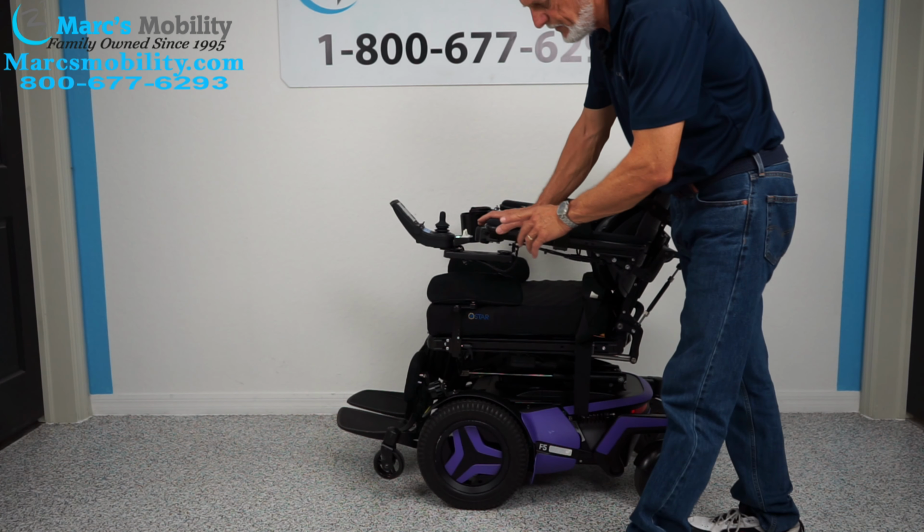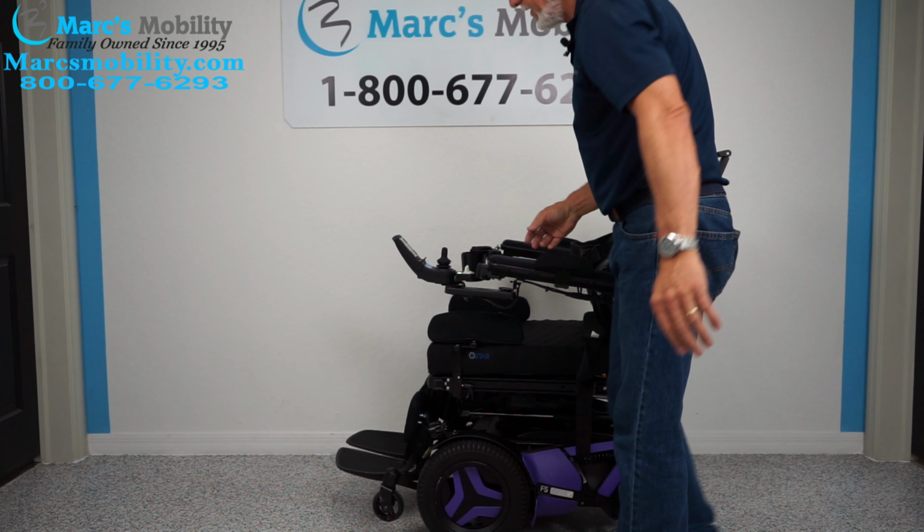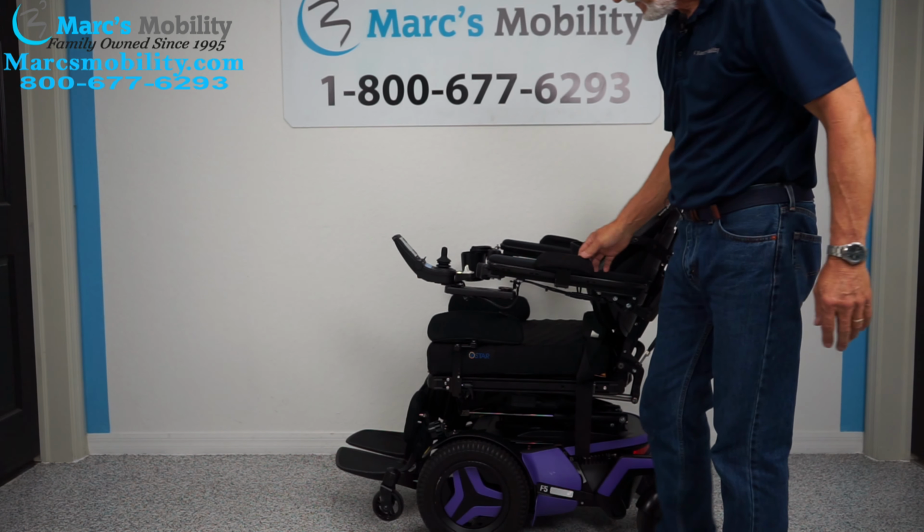But that function can only be worked through the joysticks. All the other 6 functions can be worked through here, okay? I'm going to put the chair back in drive, and we're going to talk about the chair.